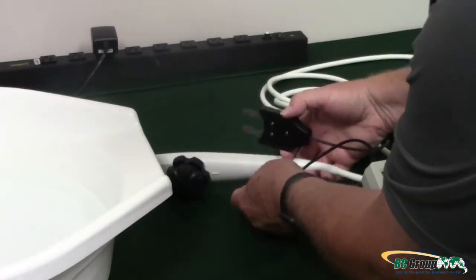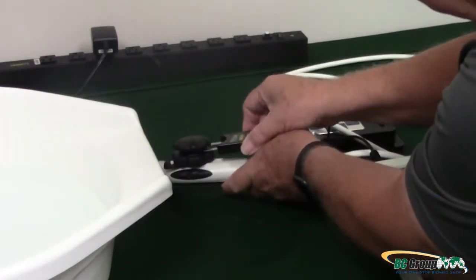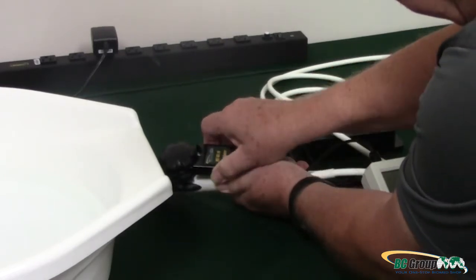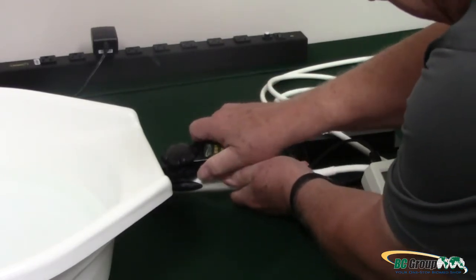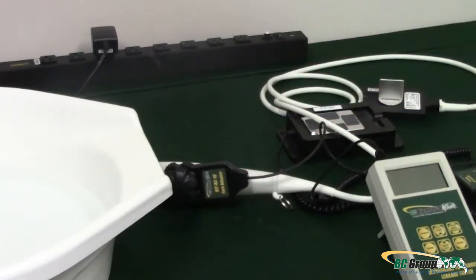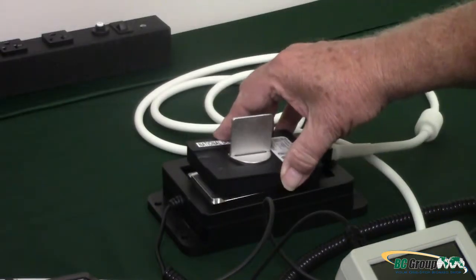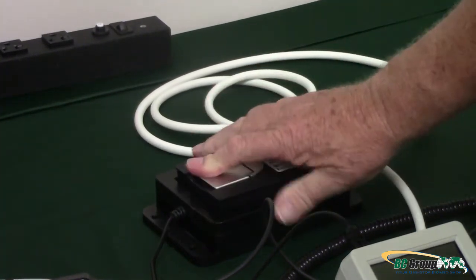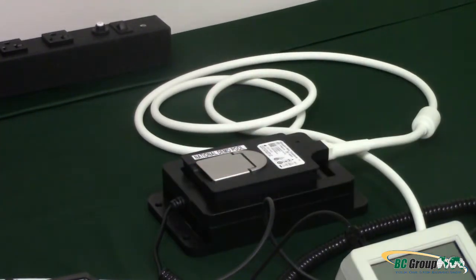Next, gently insert the Fork Adapter between the two deflection control wheels on the Ultrasound Transducer until it firmly clips onto the shaft. Plug the Ultrasound Transducer into the Adapter — the Adapter should click into place. Look in your Ultrasound Transducer Manual for OEM recommendations on connecting your transducer.